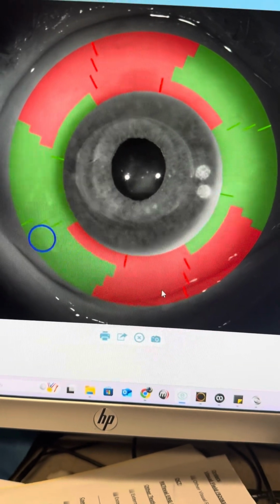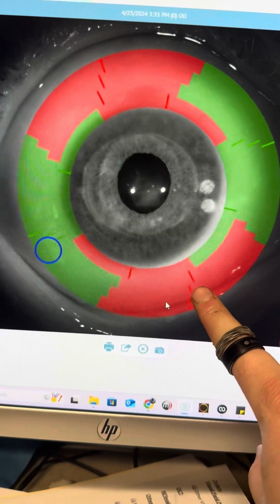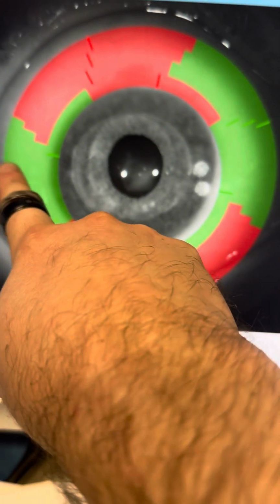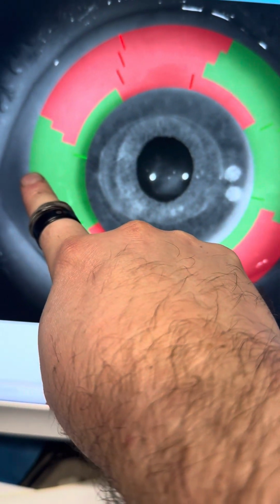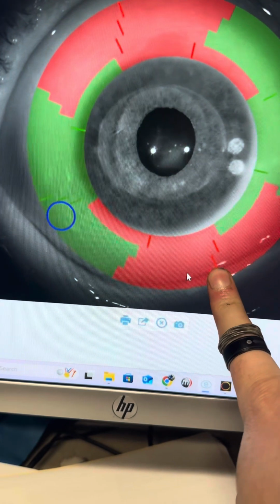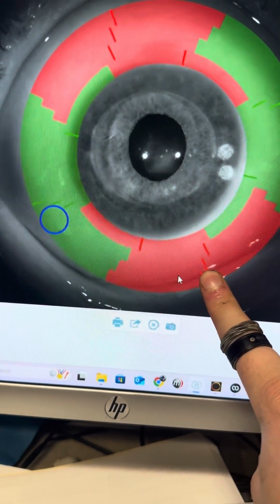So let's say the dot is at, for simplicity, let's just say 4 o'clock. And you see edge lift over here, because let's say there's a pinguicula. The lab, if you report the dot being at 4 o'clock, they're gonna know to make the change here.